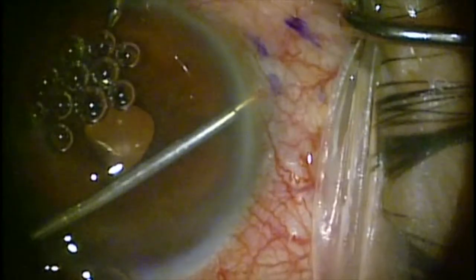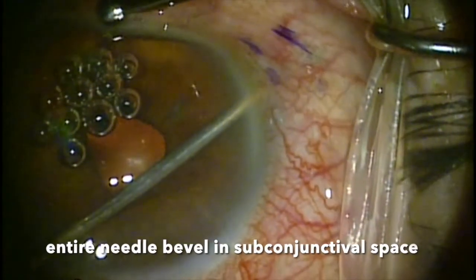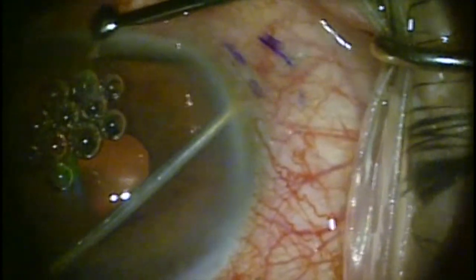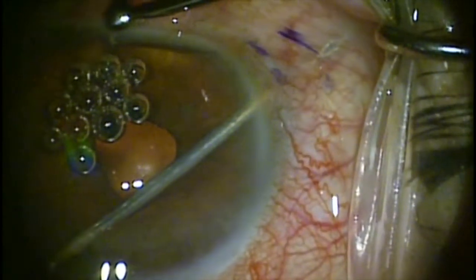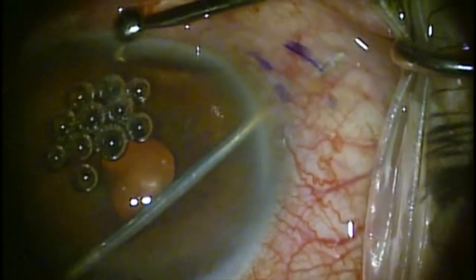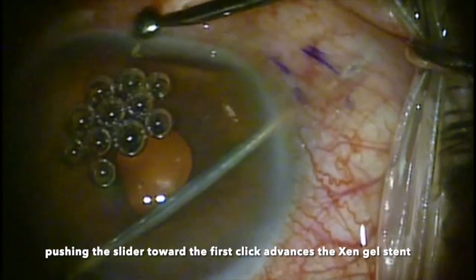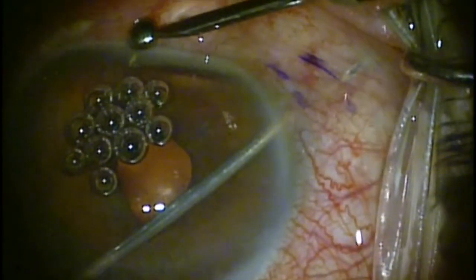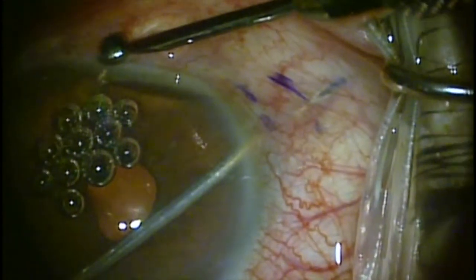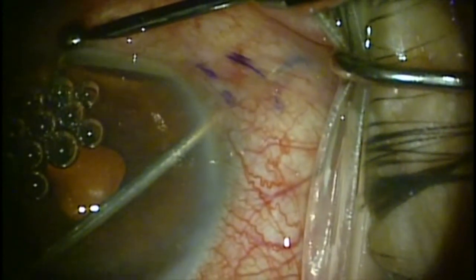The needle is advanced forward after confirming that it's in the angle. It's important that it's in the angle because if it's placed posteriorly it can lodge in the iris, and if it's placed too anteriorly it can scrape up against the cornea. You're going to advance the needle up to the second marking, two millimeters posterior to the surgical limbus, and it's very important that the entire bevel of the needle is in the subconjunctival space. If you don't have the entire bevel in the subconjunctival space, there can be a lot of resistance to the Zen being inserted into the proper position. Once the full bevel is in the subconjunctival space, I find it very beneficial to wiggle the needle side to side to clear out a space for the Zen to be implanted.